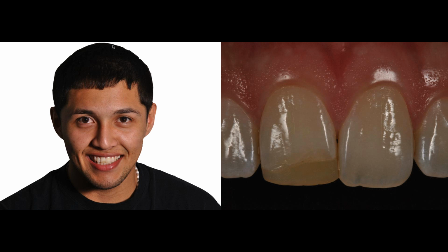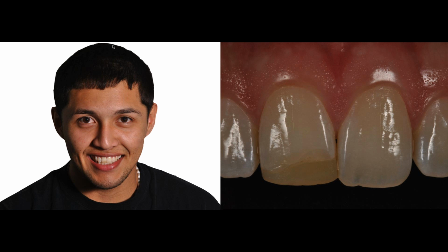And this is the way that we actually do photography. This is how our patients come to our practice. We take a full face photo, and we just want them to be themselves. And then we talk about them and we show them this. The feeling that I get when I have this kind of photos in my practice is that I get a little bit more involved in my clinical cases because I want to make these people happy.